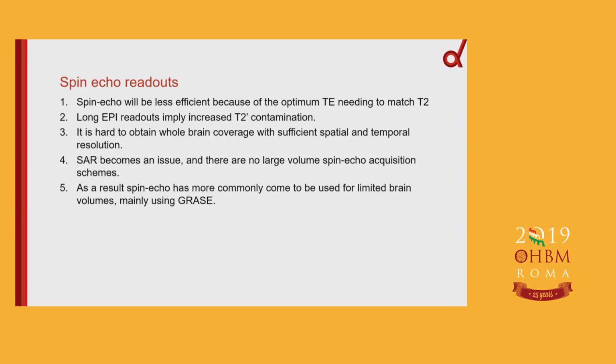People after me, I could have talked about this for a long time, but I won't, will talk a lot about whether you want to look at large areas of brain and how regions are interacting, or whether you want to look at small regions of the brain and try and get a real true representation of the laminar activation profile of that region. If you go for these limited brain regions, of course, you can't really look at interactions very easily, but you do stand the chance of absolutely optimizing everything in that volume in terms of the shim and the B1 homogeneity, etc., etc.